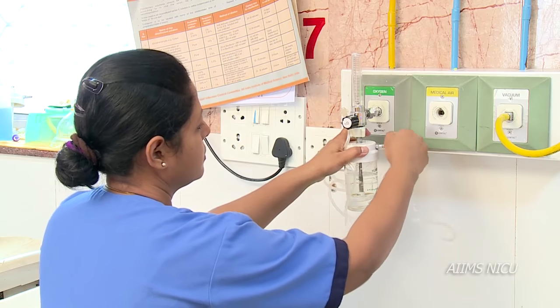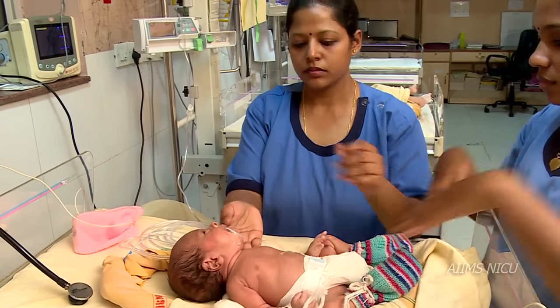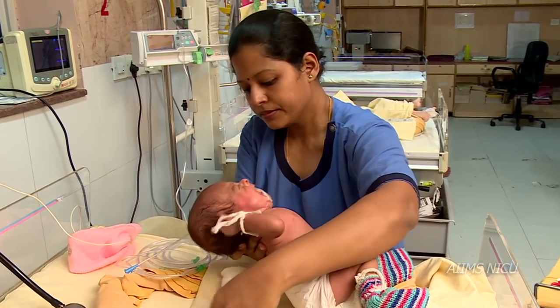Let's first learn oxygen administration by hood. Position the newborn's head in the midline and keep it in a slightly extended position by placing a shoulder roll if required.